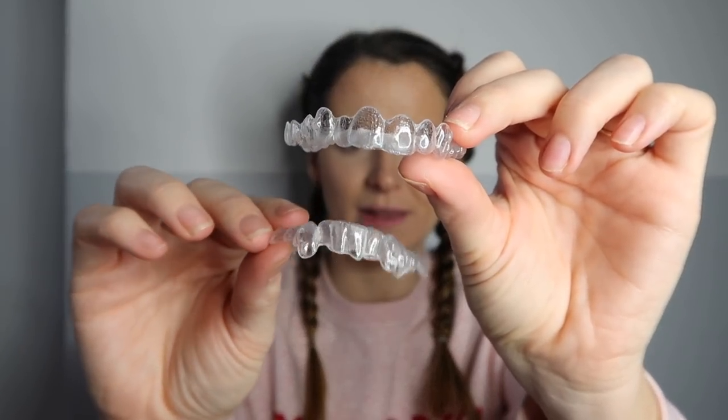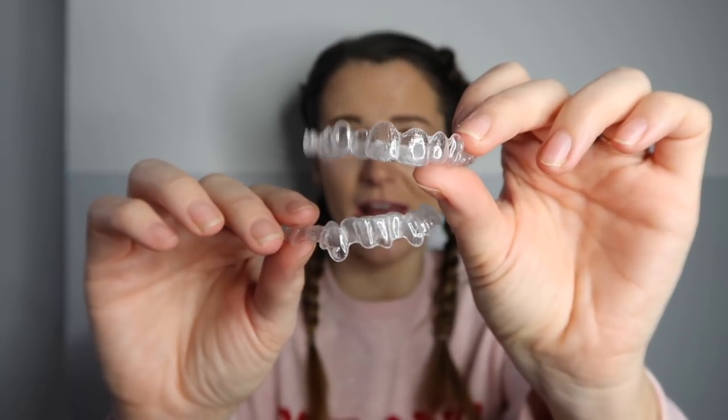I always find that when I first put a new set in they smell and taste like spring onion, which is really weird. Quite a lot of people say they taste a bit clinical, and I've heard others say they taste really sweet, but mine really do taste like spring onion which makes me feel sick — so quite often I'll wash them and scrub them with toothpaste before I put them in. Here are my new trays — there's the top and the bottom. They don't look that much different to the old ones other than the fact that they are super, super clean. So that's the top one out.